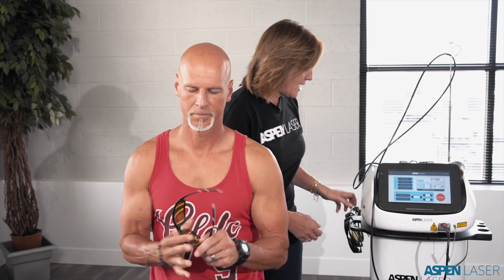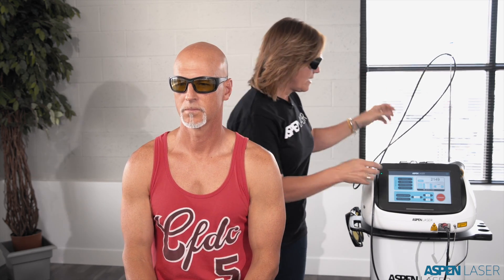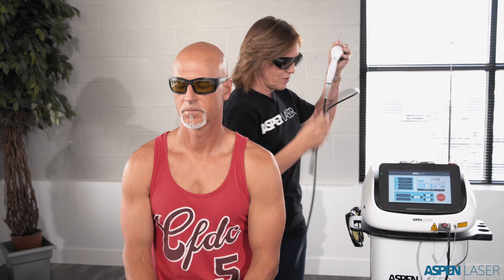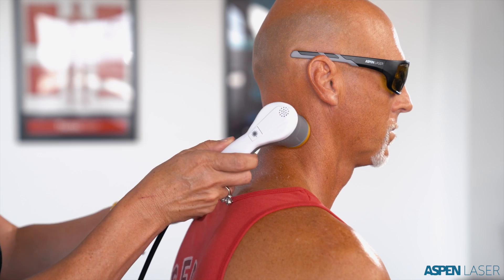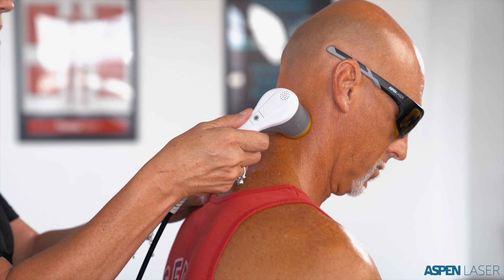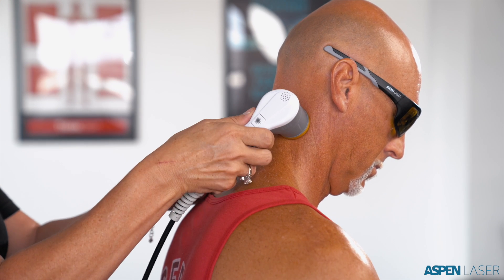At this point I ask the client to put on the safety goggles. Anybody in the room within six feet of the equipment needs to be wearing safety goggles at all times. I select my handpiece, place it in the palm of my hand, and pull the fiber optic cable off so I have good range of motion while treating. When I press the red button that says standby, it goes to green — the laser is armed. I have a guide light, which is red, just for the purposes of seeing where I'm treating. I place the handpiece directly against the client's neck where he said the pain is most prominent and click the button one time.